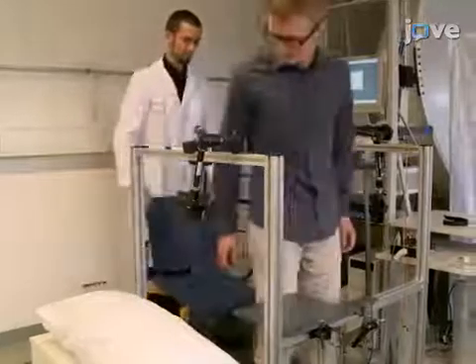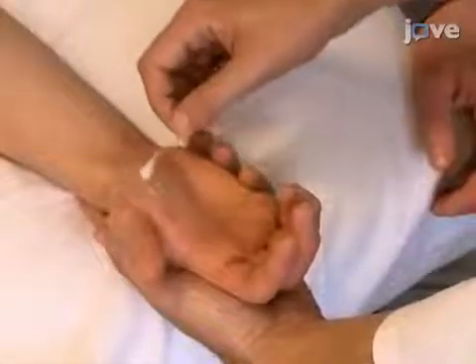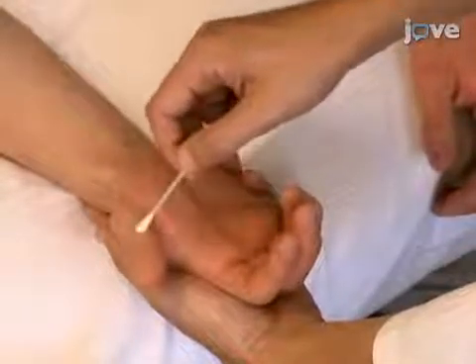Begin by asking the participant to sit comfortably in the chair. Clean the participant's skin by rubbing preparation paste in the regions of the hand where electrodes will be placed. Remove excess with a clean gauze pad.